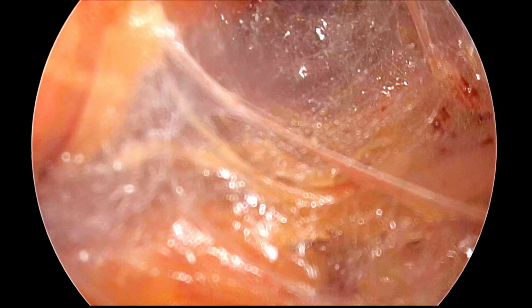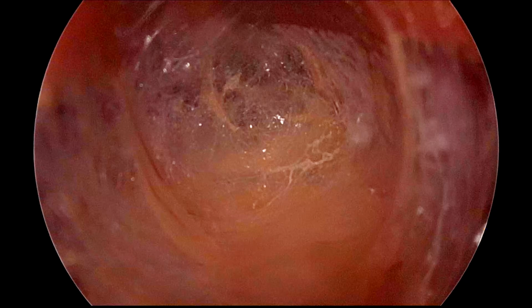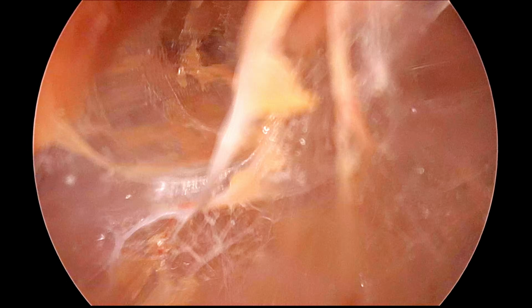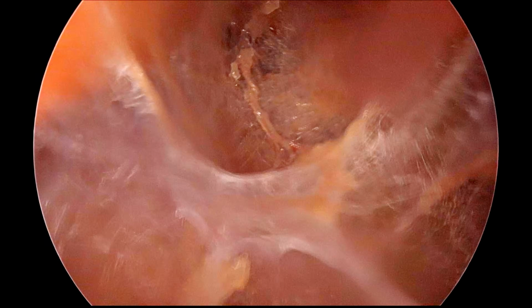You can see this is the areolar tissue, and as we know in laparoscopy always white is right. So always go to the white-colored fascial plane and slowly try to go towards the midline, a little towards the pubic tubercle on the left side, and then slowly make a lateral sweeping movement.